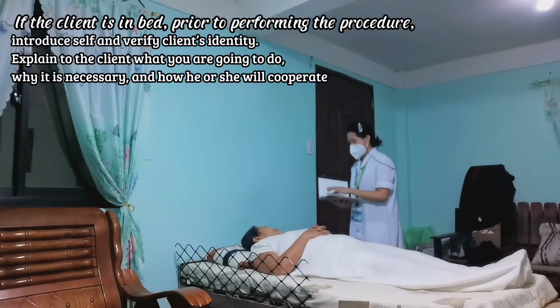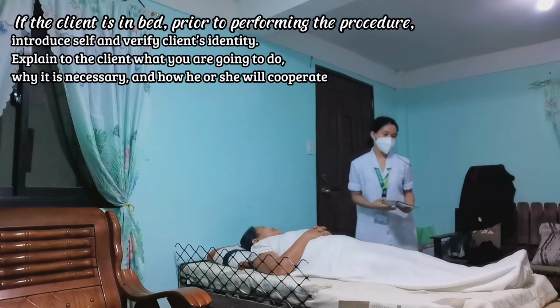Nice to meet you, Ma'am Adin. So, ma'am, first, I will begin gathering all the equipment and perform hand hygiene. Is that okay with you, ma'am? Okay, thank you.